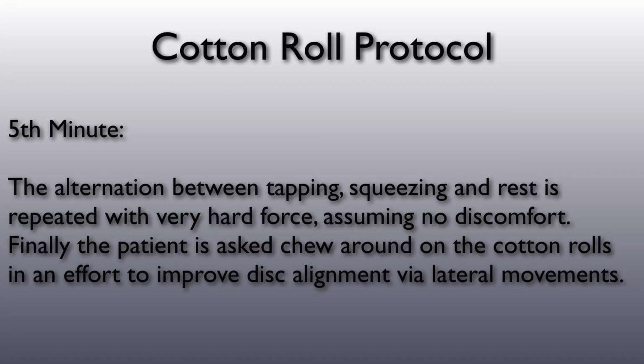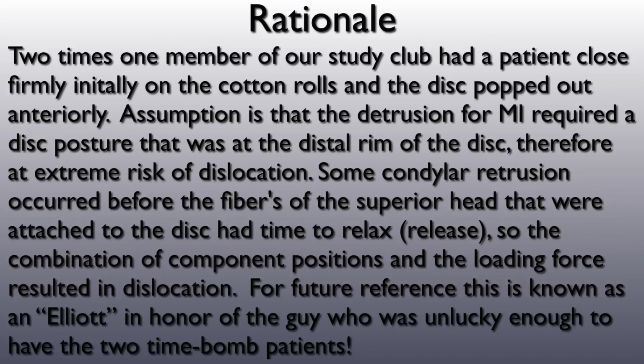Finally, the alternation between tapping, squeezing, and rest is repeated with very hard force, assuming no discomfort. Finally, the patient is asked to chew around on the cotton rolls in an effort to improve disc alignment via lateral functional movements. The rationale for all of this is as follows.